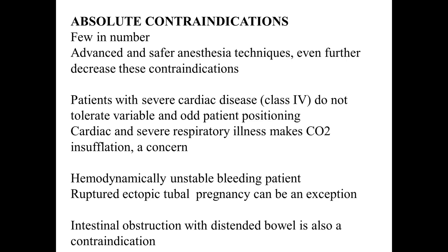The one thing with laparoscopy I'm going to mention here is that for any minimally invasive procedure, you have to put the patient in different positions. For example, if I'm operating at the esophageal hiatus, just under the diaphragm where the esophagus comes down and converts into stomach, and I want to treat the disease there, I will have to put the patient with the head extremely up and legs down, so that everything falls down and I'm able to see the hiatus, which is generally overlapped by the left lobe of the liver.